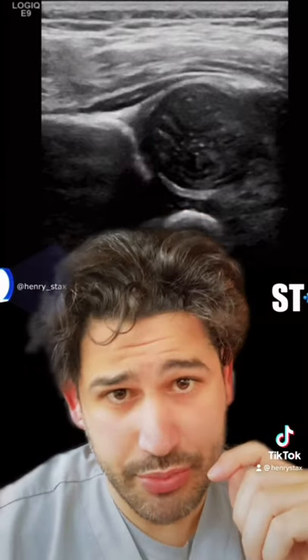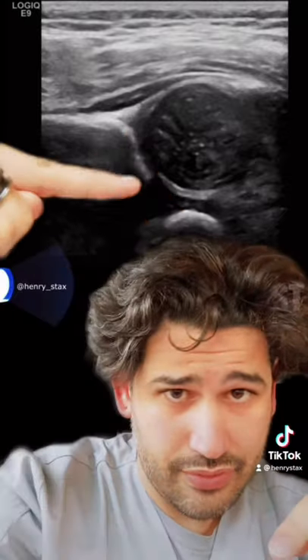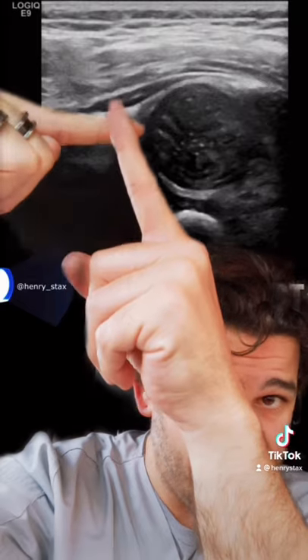This is an excellent view to get your measurements. You want at least 50% coverage of the femoral head. Using your ilium as a baseline and then your acetabulum, you get your alpha angle. You want your alpha angle to be 60 degrees or above.